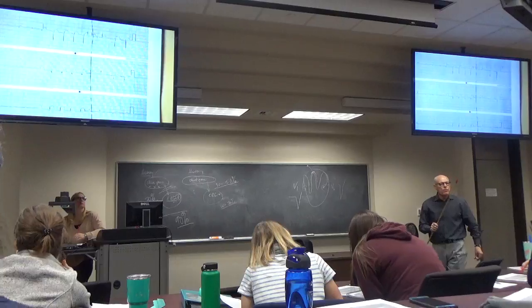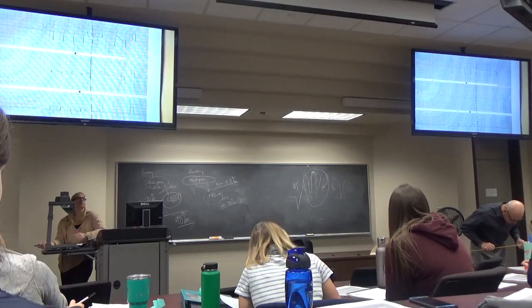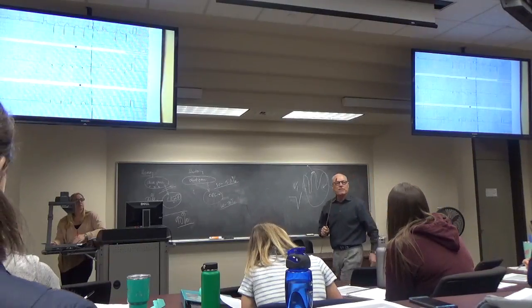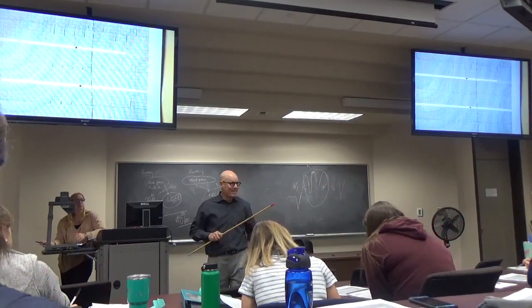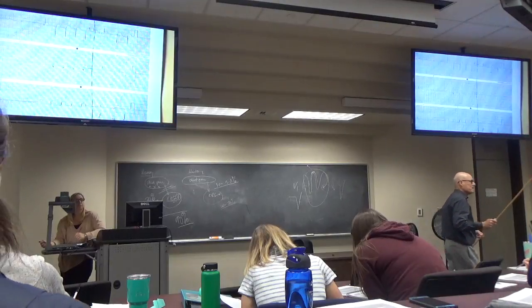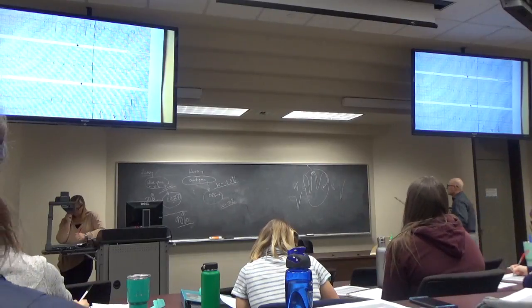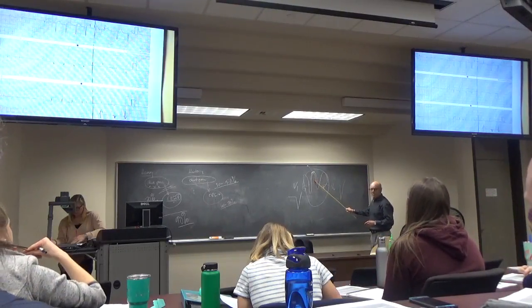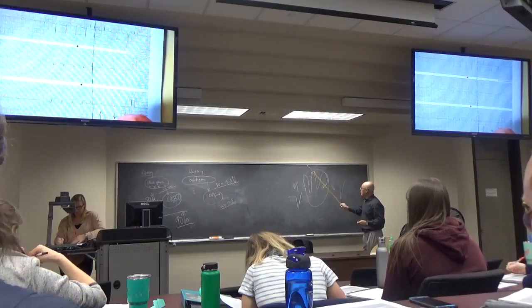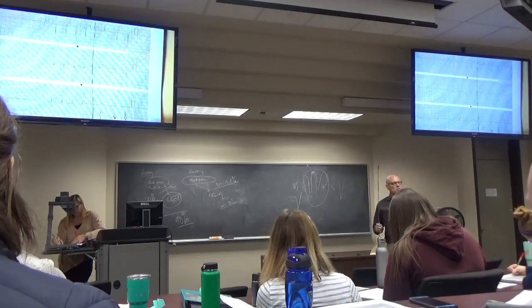So what has happened in V4 is that for that brief period of time, you look at V5 and V6, same thing's happening, isn't it? Yeah. So for that one beat, the patient's conduction was different than the rest of the EKG. That gives us support for the fact that for some of those beats, probably two of them, it's coming through the AV node. For most of them, it's coming through the accessory pathway. And for one beat, it came through the AV node. That's how you explain it.